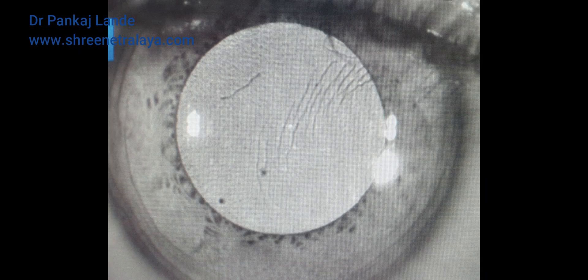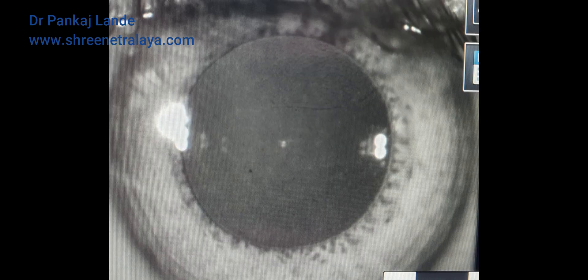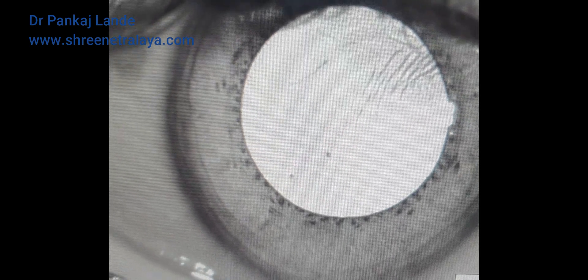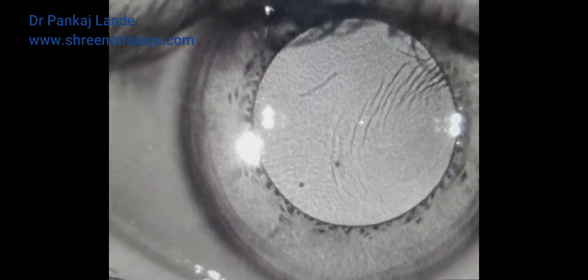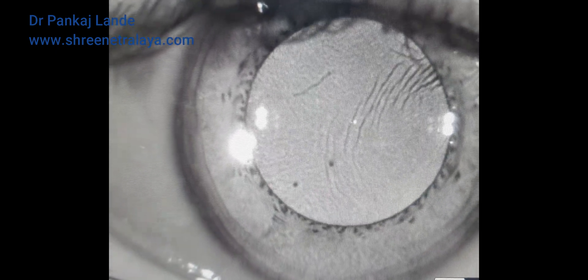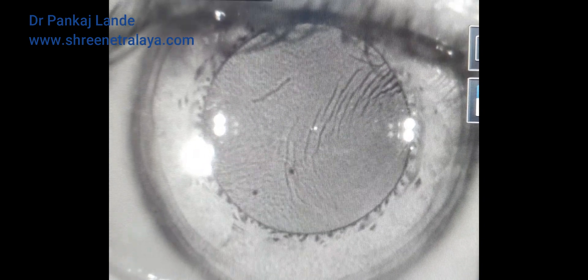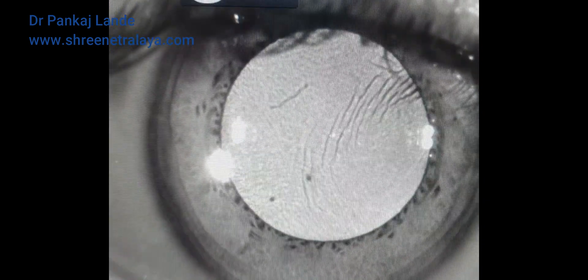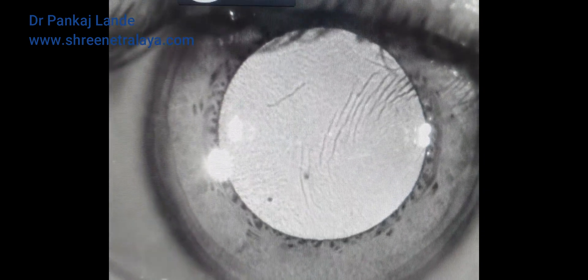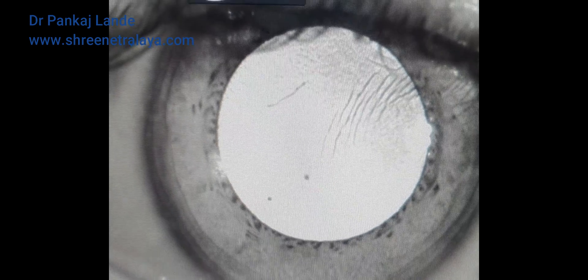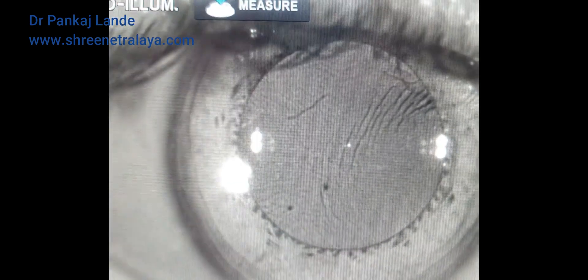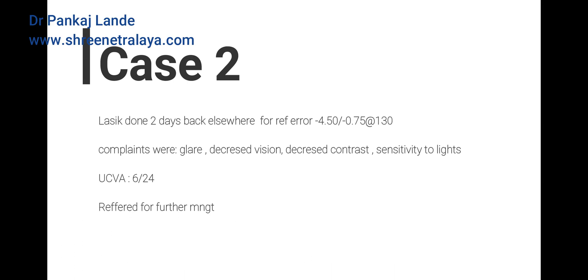In this video you are seeing a retro-illumination image of a LASIK flap showing folds in the flap and a cotton fiber. You can easily demonstrate the folds in the flap in this small video. Retro-illumination image on the auto-ref machine is one of the very important tools to diagnose LASIK flap striae.